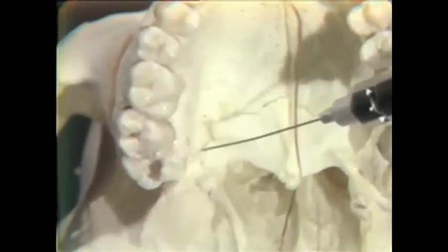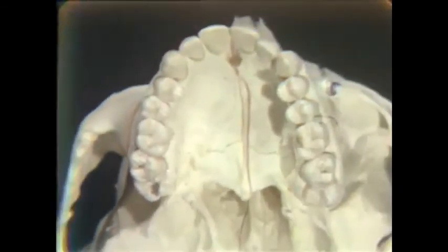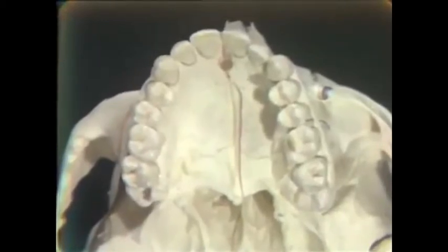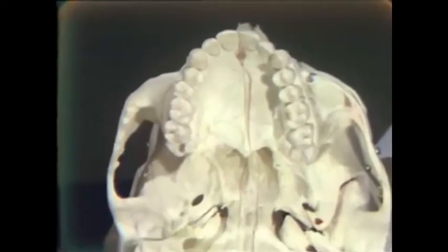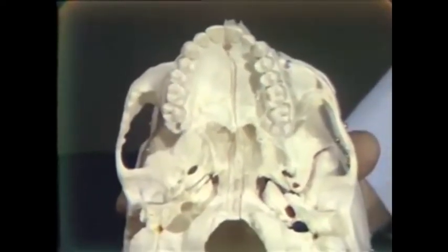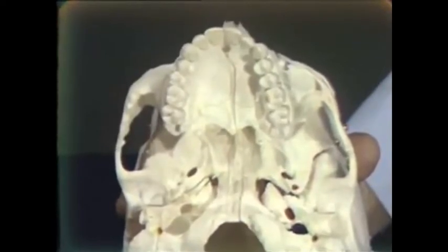Now this will anesthetize, as we said before, all of these palatal soft tissues from third molar to cuspid, which would be advantageous, for instance, if you're going to remove a quadrant of teeth and manipulate all of these palatal soft tissues from third molar to cuspid. Now on occasion, you may just be carrying out instrumentation on one tooth or removing one tooth.